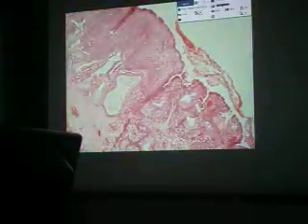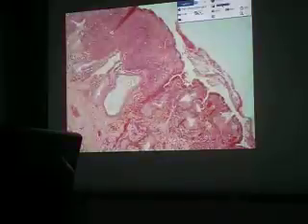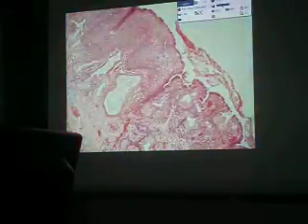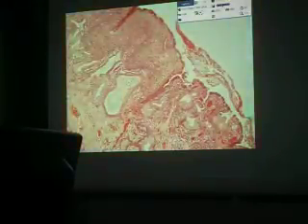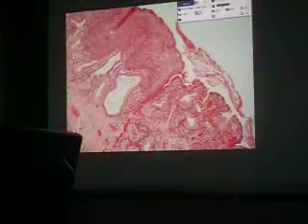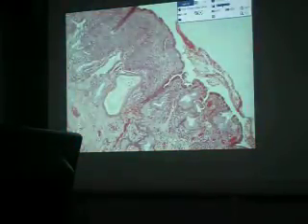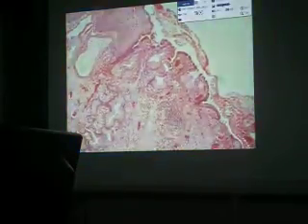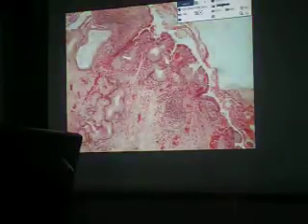Now, what portion of the female reproductive tract will display those two types of epithelial tissues? The cervix. So that pointed portion is the endo or the exocervix? The exocervix. And then that should be the endocervix. Okay, the invaginations of the epithelium will form the endocervical glands. Okay. So, in that portion of the cervix, what is your diagnosis?